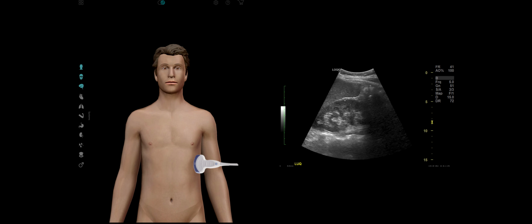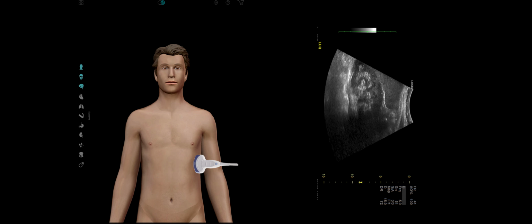So on the body, if we were scanning, for instance, the left upper quadrant and had this kind of screen, you would have your marker by convention on this side, which equates to this. And as time goes on, you'll understand that that equates to effectively this kind of picture to orientate yourself, which means that this is going to be your spleen, this is lateral, this is medial, these are the vertebrae, and this is your kidney. So kidney, more superficially, you're going to see your spleen. This is going to be your skin out here, as this equates to the image.